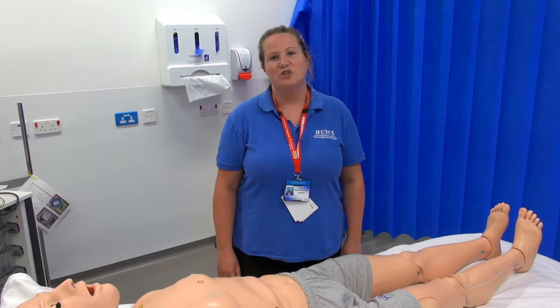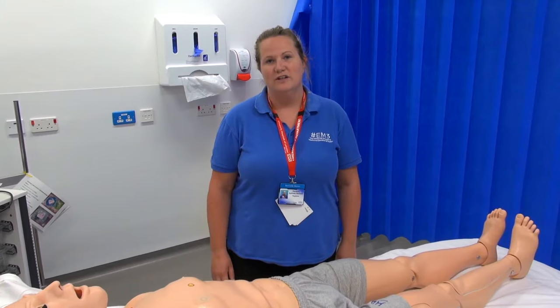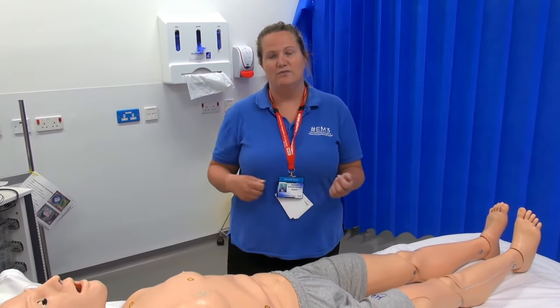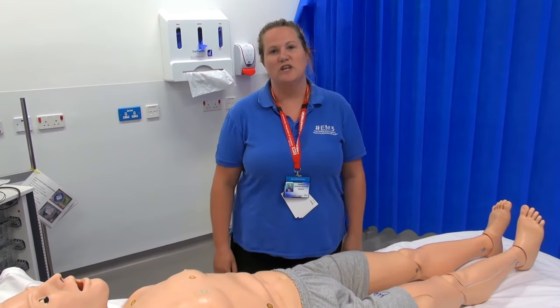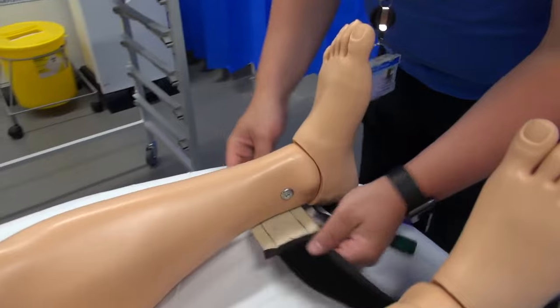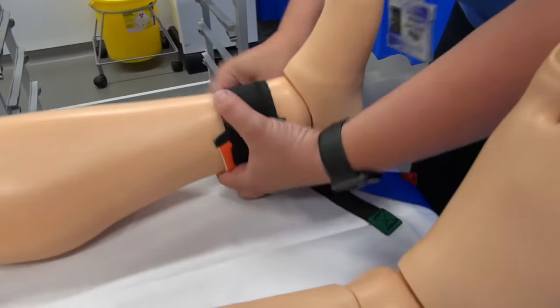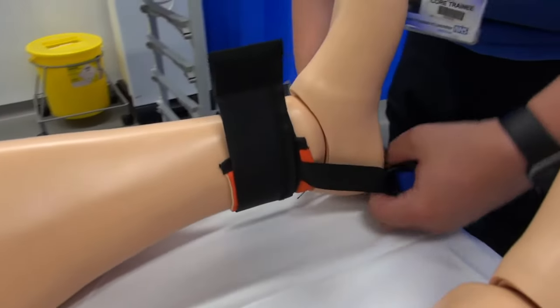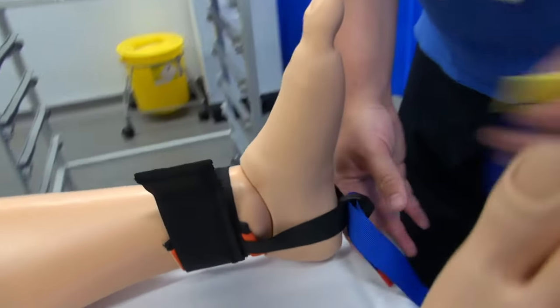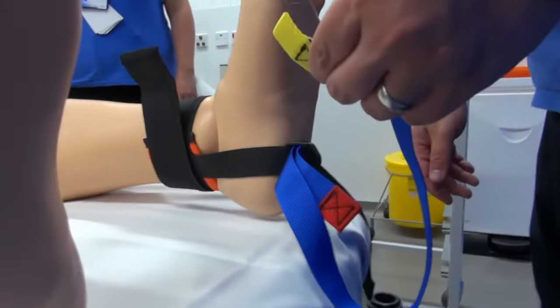At UHL it's the doctors that need to apply the traction, so if a member of nursing staff is doing this procedure, when the traction device is tightened you need to make sure it's the doctor that does that. First, attach the ankle hitch underneath the ankle and secure with the velcro. The section goes underneath the foot — make sure that's tight. Ensure the yellow section is long and the red section is short.